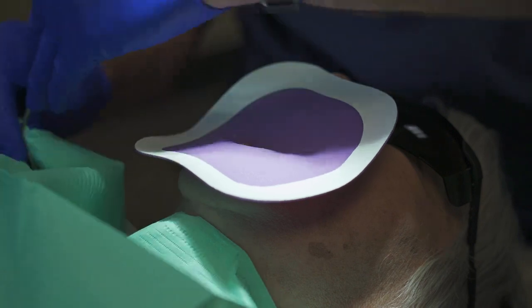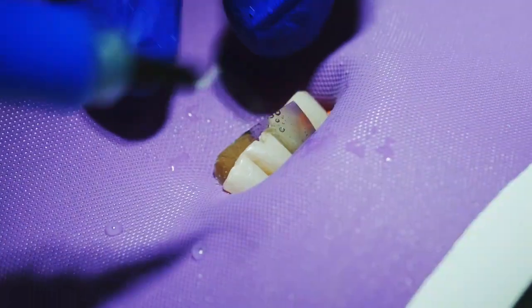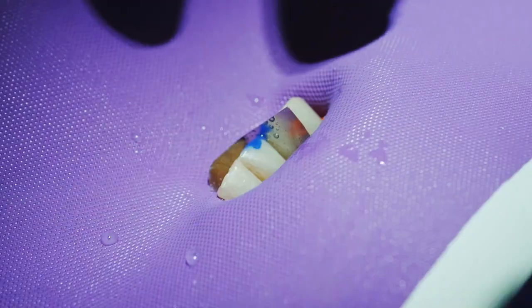I like to acid-etch that space to make sure we don't have any tooth fragments in the hole. We'll let that sit for a few seconds, then rinse it.